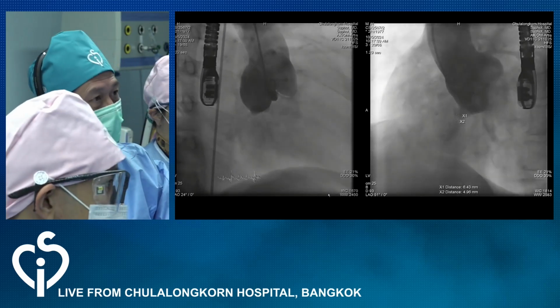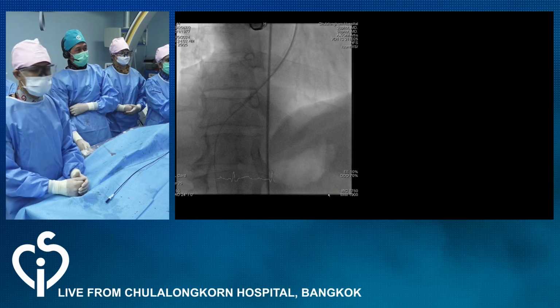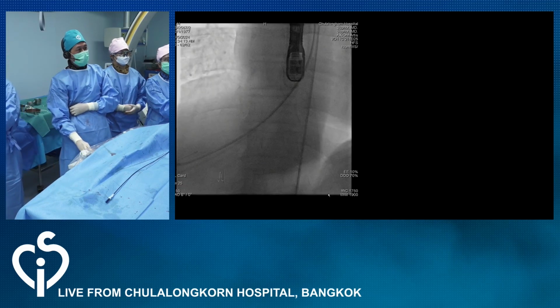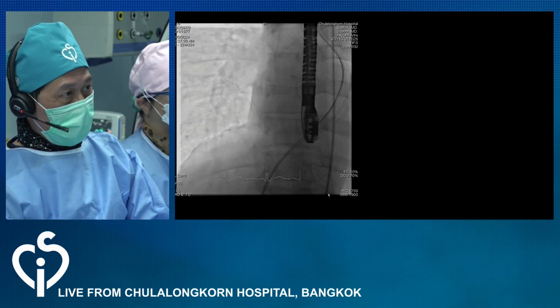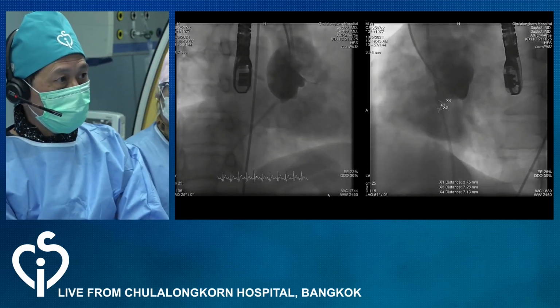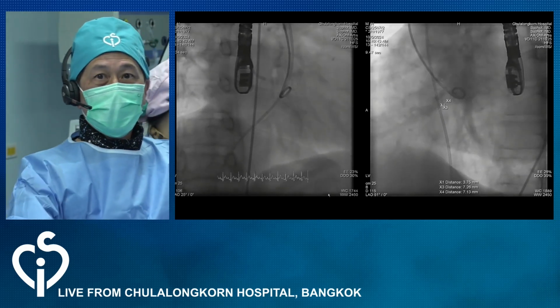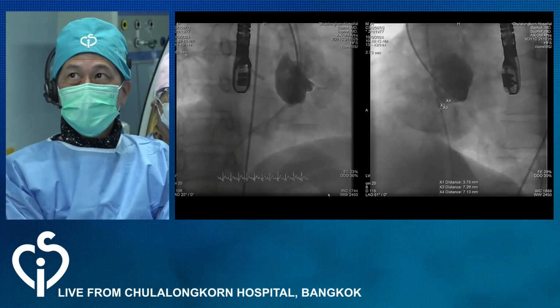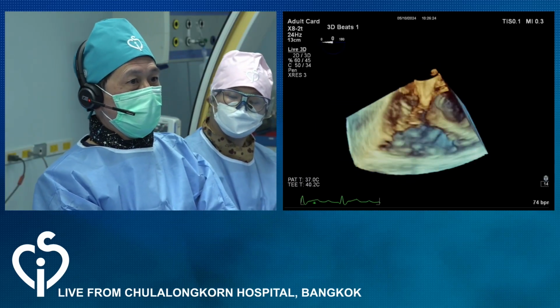And on transesophageal echo, do we see some sort of a windsock appearance that Bharat was asking about? Or we don't? Please show the TOE. No, we don't see the TOE yet. Can you show the big echo? Yes, okay. You see, this is a transesophageal 3D echo.